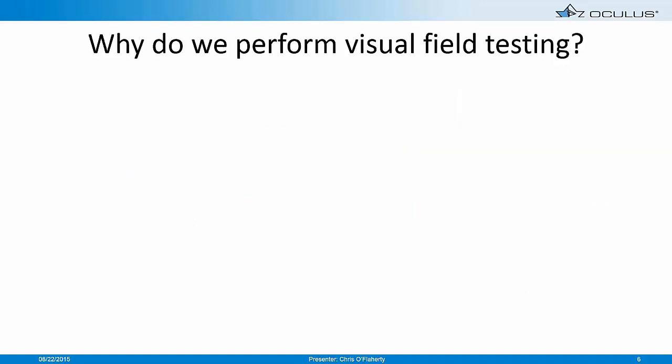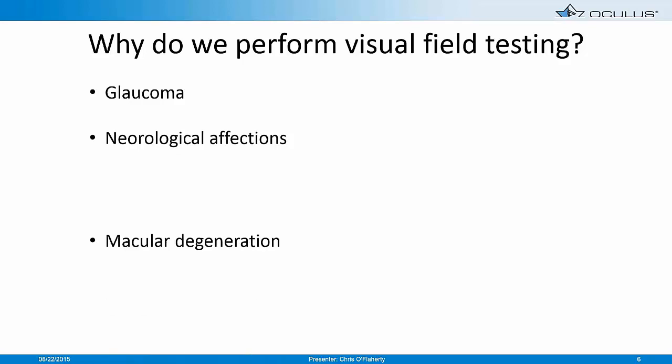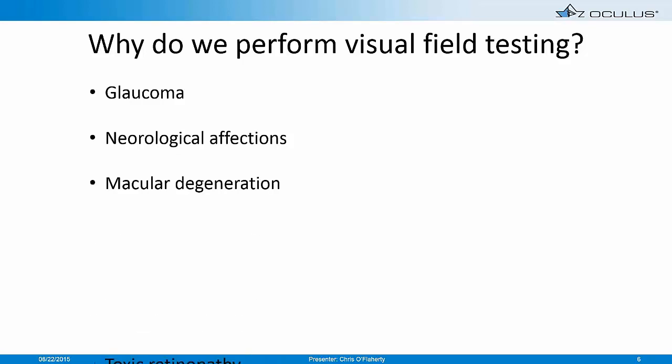So why do we perform visual field testing? Well, primarily for glaucoma. We also can assess neurological defects, macular degeneration, toxic retinopathy, and there are applications for plastic surgery as well, etc.